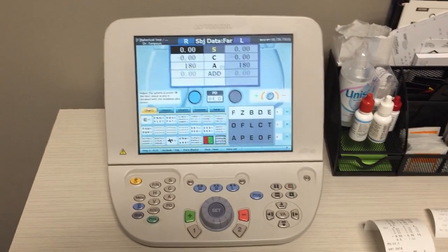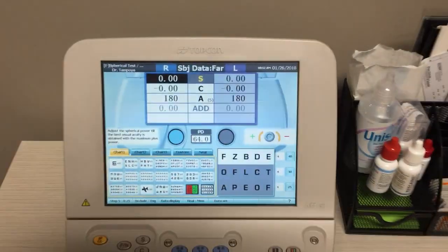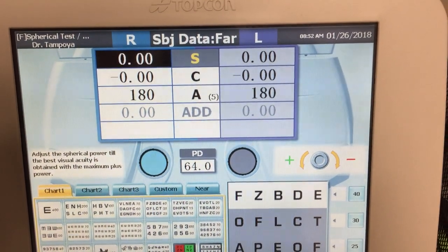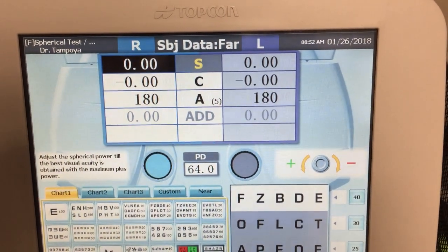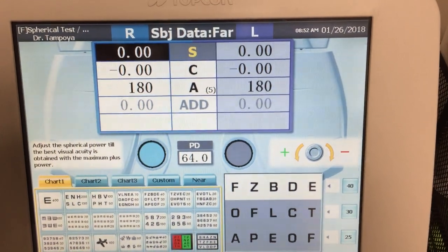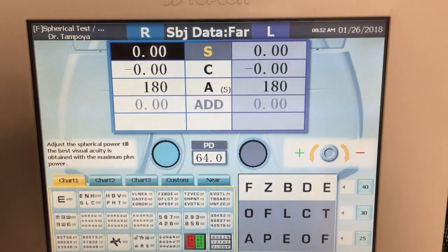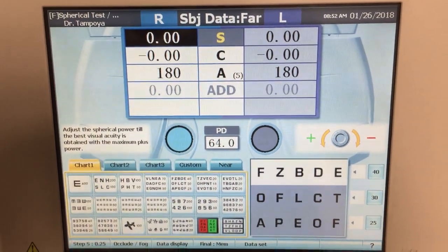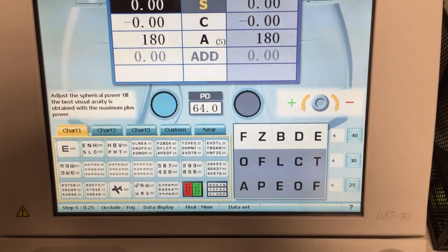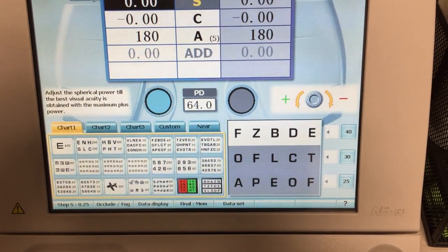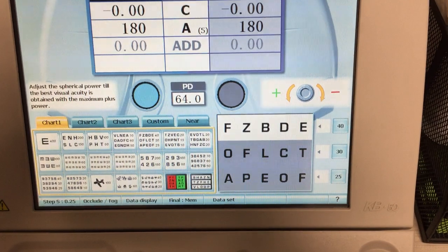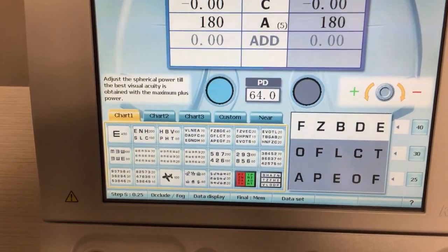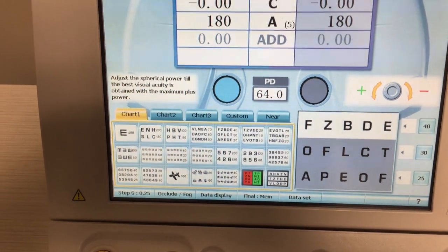This here is the control panel for the autophoropter. On the top of the screen you'll see the data for the sphere, cylinder, and axis. The left side of the screen shows the numbers for the patient's right eye, and the right side shows the data for the patient's left eye — like everything else in optometry, it's through the patient's perspective. The lower right side shows the letters that we are testing, so the 2040 line here is highlighted, which is what's being shown to the patient. On the lower left side of the screen you can see various different charts that you can pick.